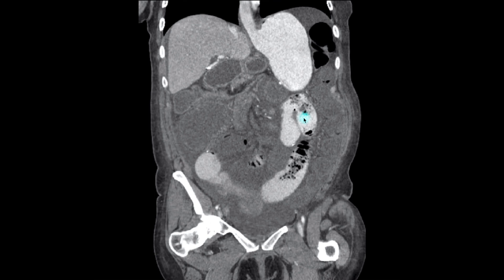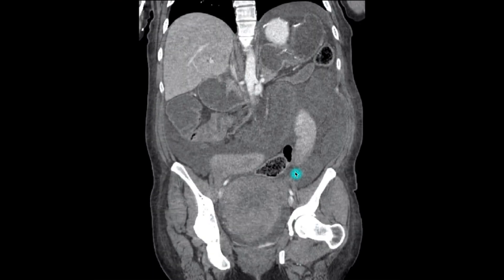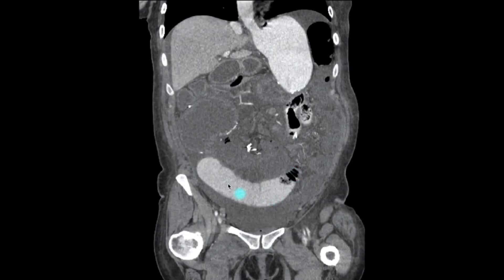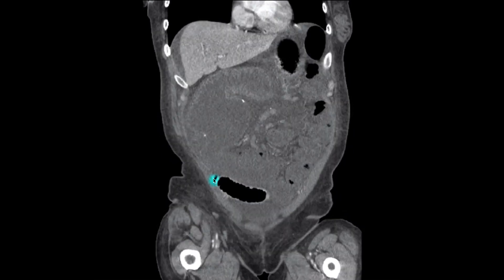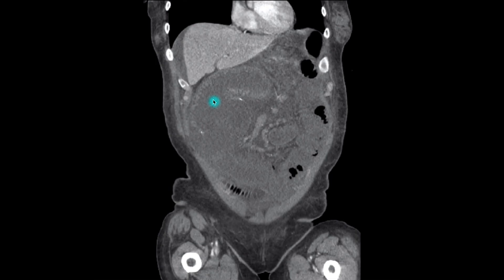Here, we have the dilated Roux limb. As we move anteriorly, we notice that the dilated Roux limb is to the left of the dilated jejuno-jejunostomy. Therefore, the dilated jejuno-jejunostomy is anterior and to the right of the dilated Roux limb.